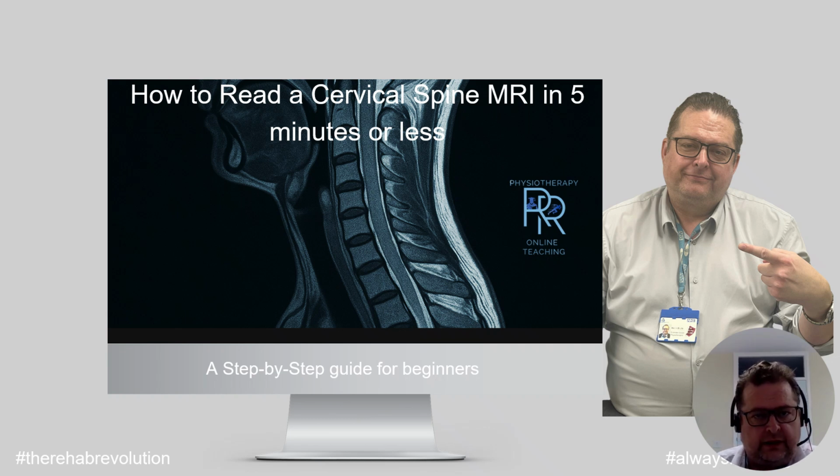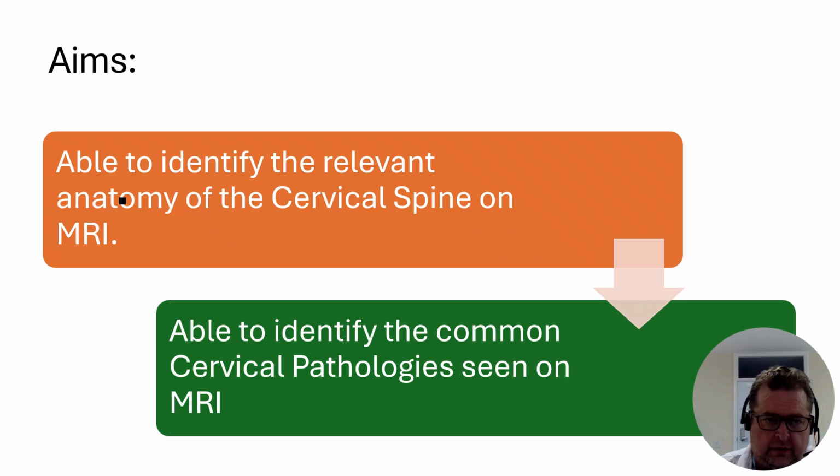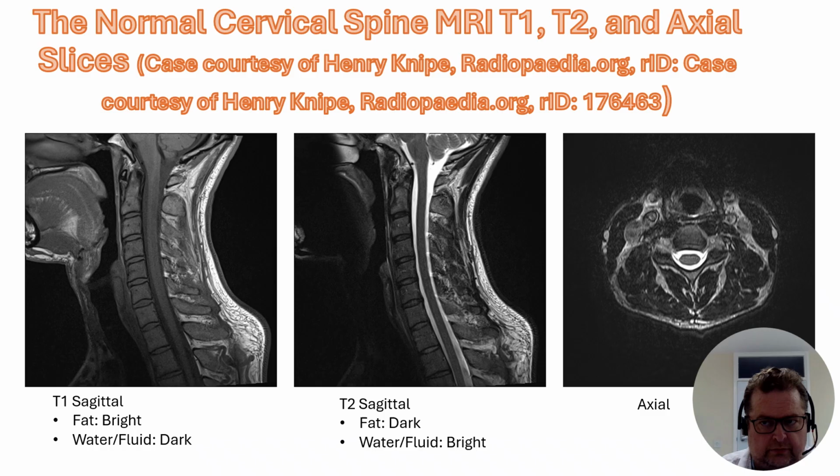Hi rehabbers, and this week the learning is on how to read a cervical spine MRI in 5 minutes or less, a basic step-by-step guide for complete beginners. So the aims are to identify the relevant anatomy of the cervical spine and to identify the more common pathologies.